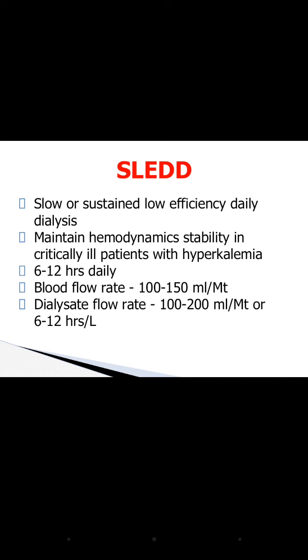It is done 6 to 12 hours daily. The blood flow rate is 100 to 150 ml per minute, and the dialysate flow rate is 100 to 200 ml per minute, for 6 to 12 hours. So this is about the SLEDD, which is used most commonly nowadays.